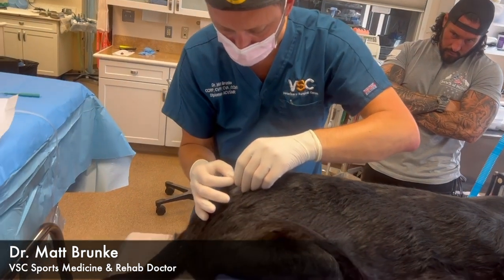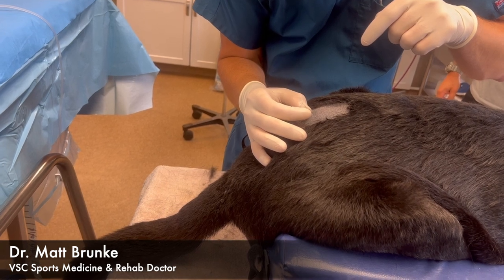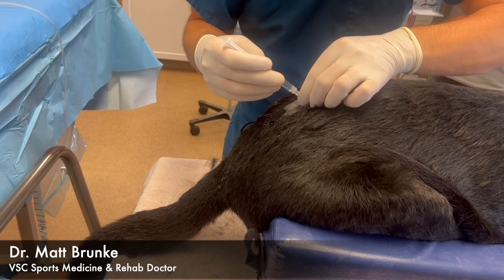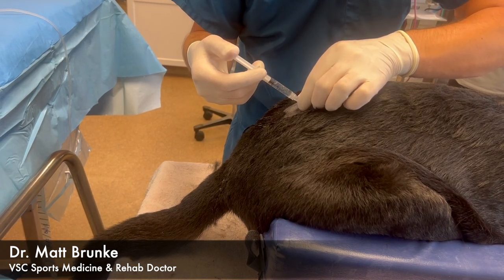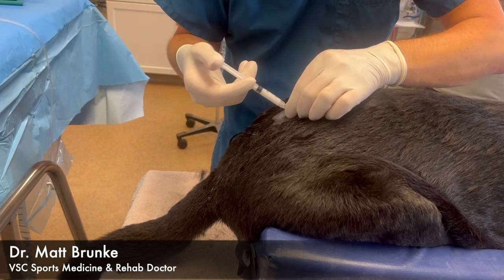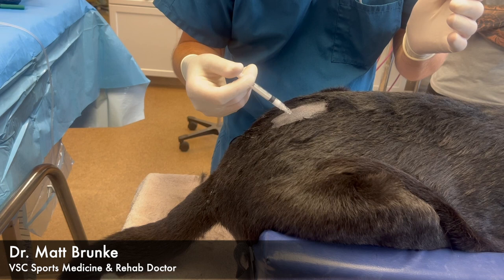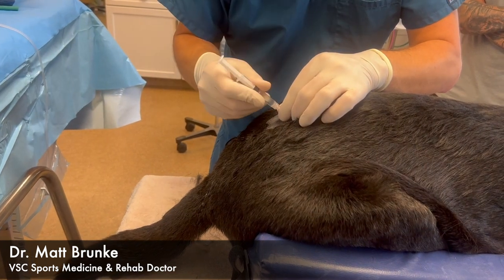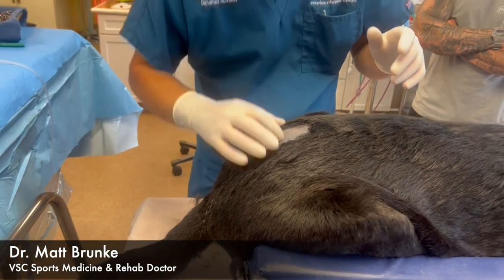We're going into a vacuum, so sometimes that little drop is going to suck down into the hole. We're going to see if there's any resistance — no resistance. We slowly expand that space and then inject the long-acting cortisone, pushing the last bit all the way through. And that's it — we're good to wake up.